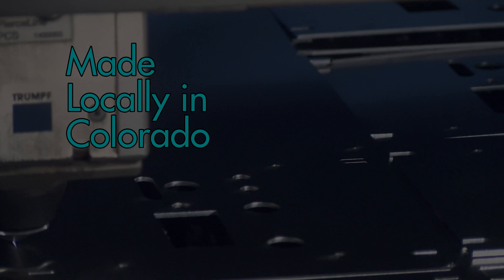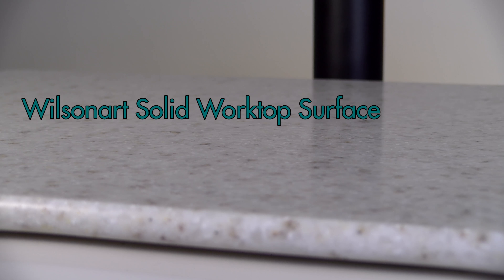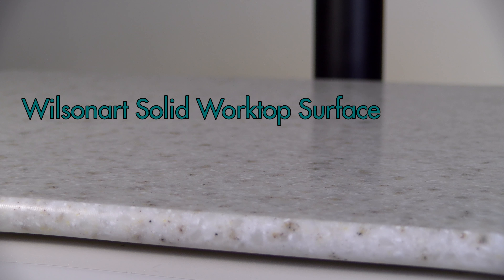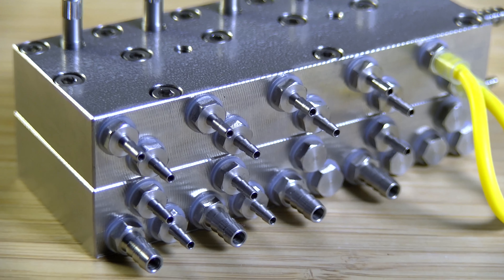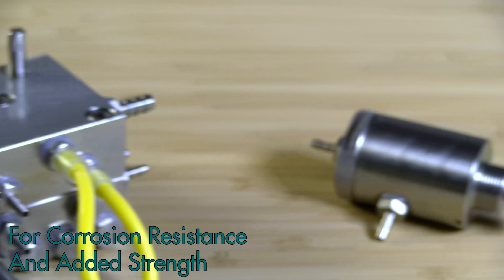Available in a variety of colors to match the decor of your office, with a Wilson Art solid surface worktop that provides the benefits of being non-porous and chemical resistant. The internal dental unit components including the control block, needle flow control valves, and water relay valve are constructed from stainless steel for corrosion resistance and added strength.